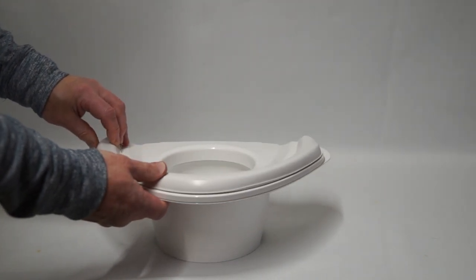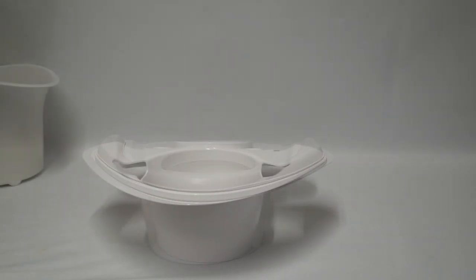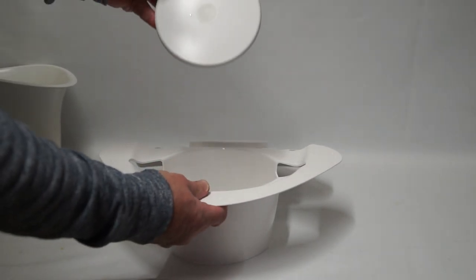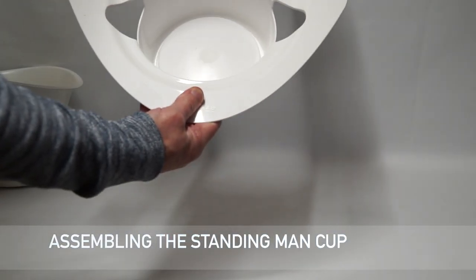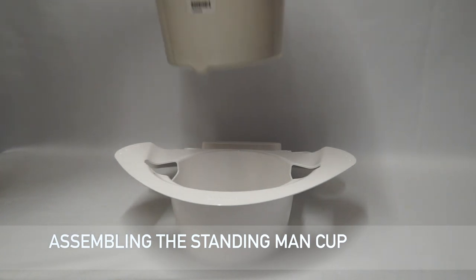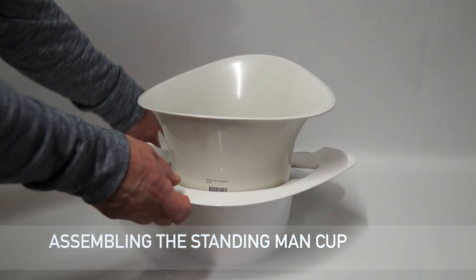If the unit is being set up for a man to use, the standing man's cup is selected. This is placed on top of the Uroflow meter. The whole assembly is then placed on top of the toilet and is ready for use.